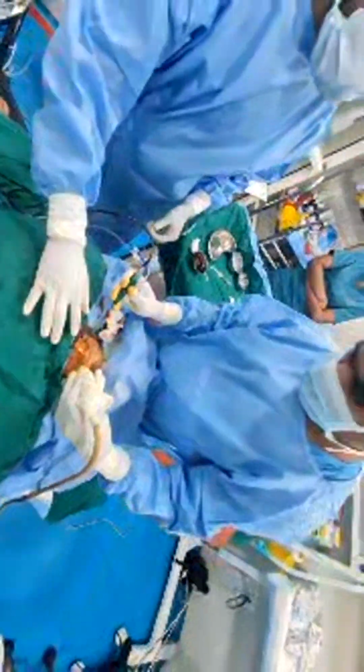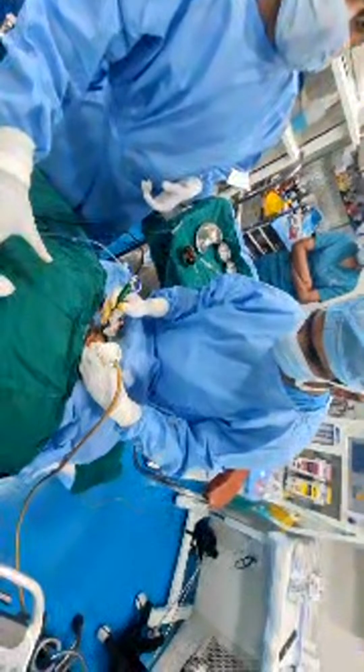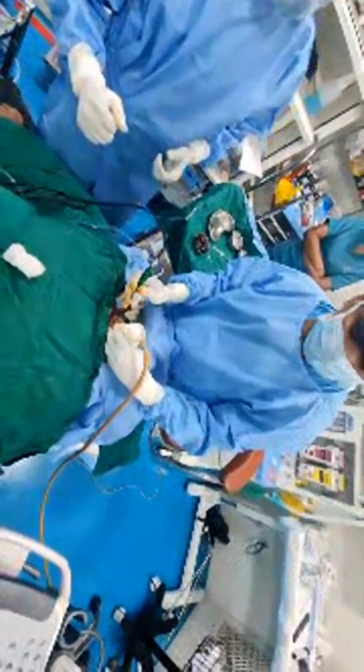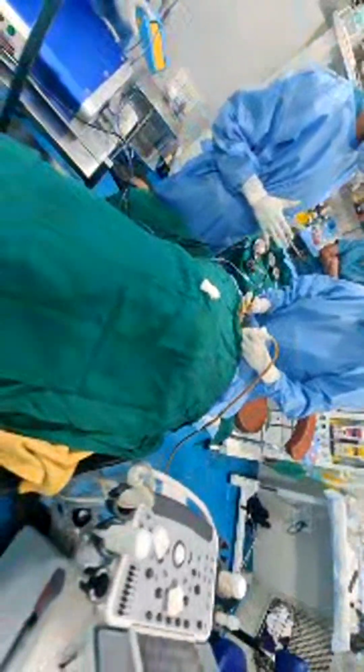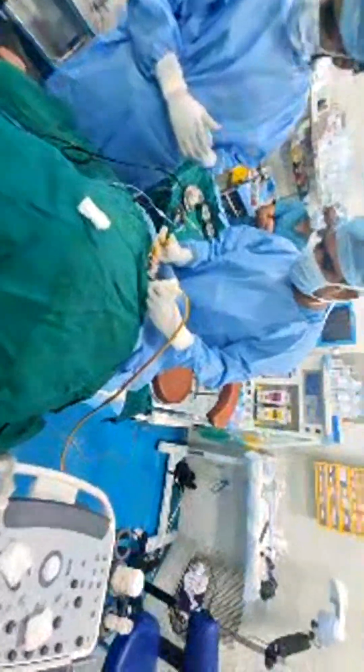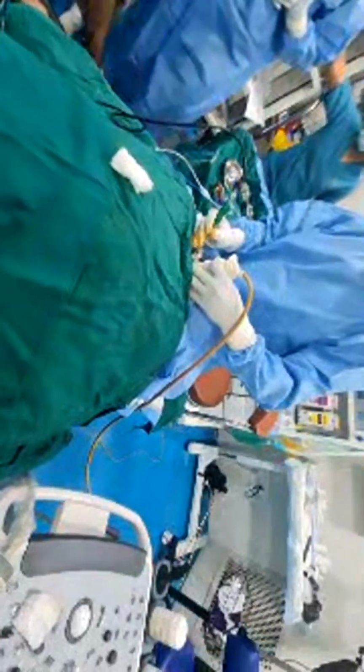So this is the insertion of the microwave needle. Usually we enter it through the transisthmic route. Transisthmic means it is through the isthmus. The isthmus is the part where both the lobes are connected. So generally we go by the transisthmic route.